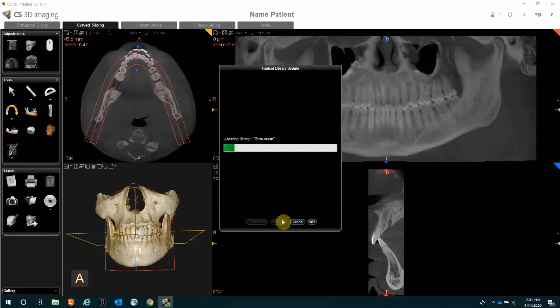You will then see a bar indicating the updating of your library. Depending on the speed of your internet and how many implant manufacturers you have selected, the time will vary. In the meantime, you are welcome to click the Hide button and continue working in your software.